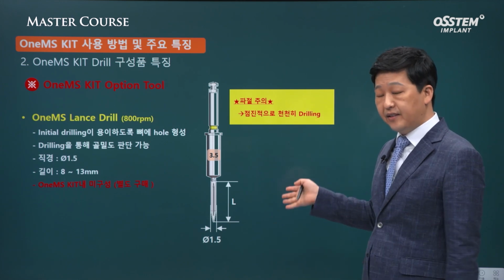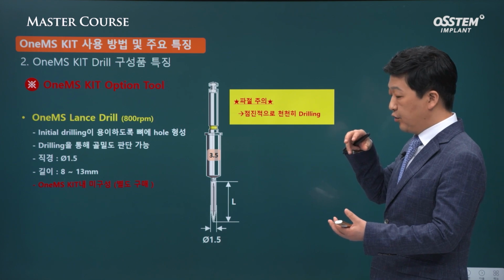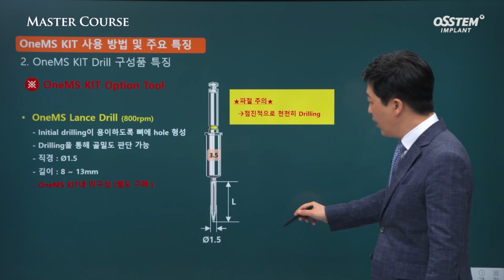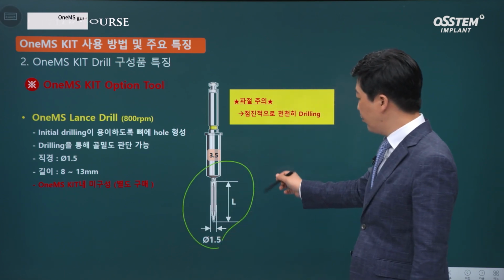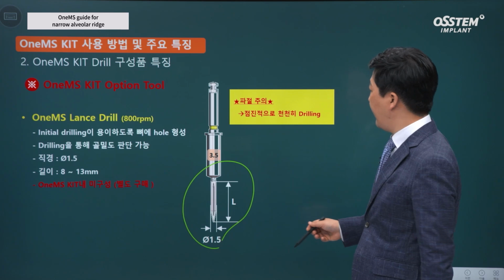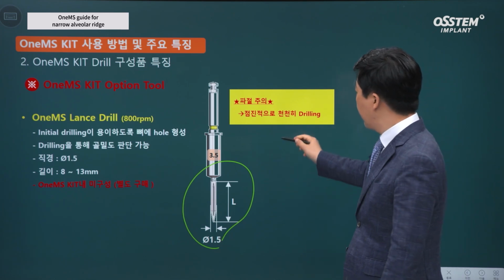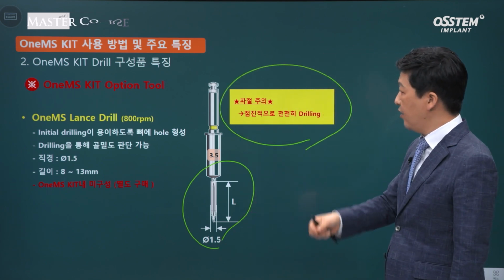This is to enter cortical bone easily. It punches the cortical bone and it allows for easy drilling subsequently. It's very thin. If you apply too much force or if the direction is wrong, there can be possibility of fracture.